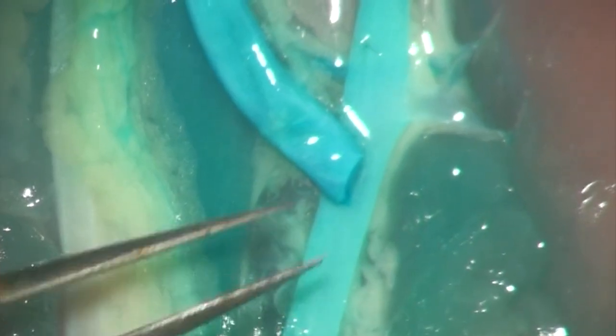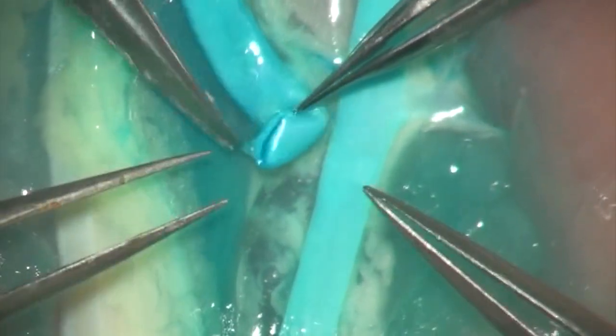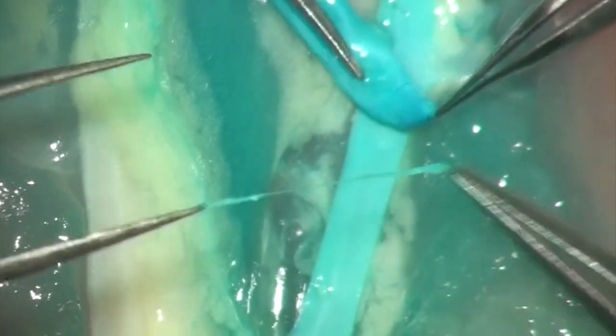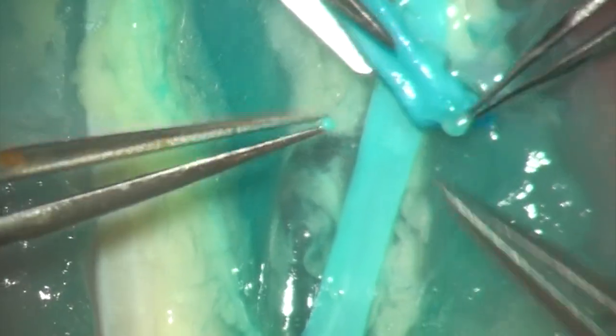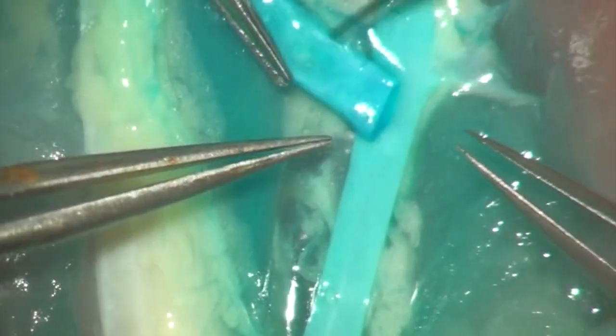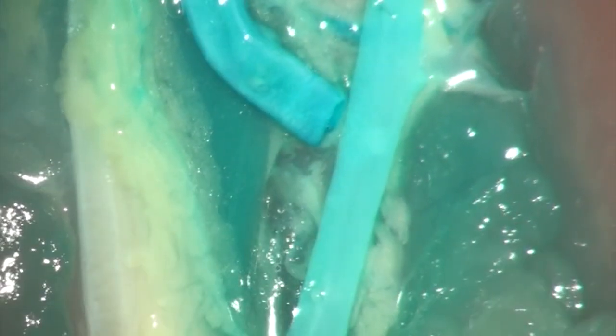This video will cover Lesson 9B of the Microsurgical Training Manual, vertical end-to-side microanastomoses. The distinction between horizontal and vertical end-to-side microanastomoses lies in the orientation of the vessels. In this situation, the recipient vessel is vertically oriented, which affects the sequence of sutures and needle positioning.